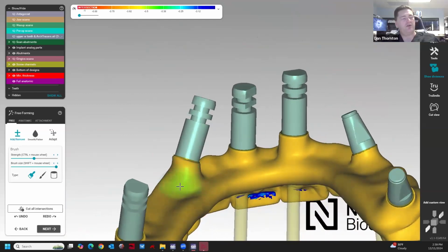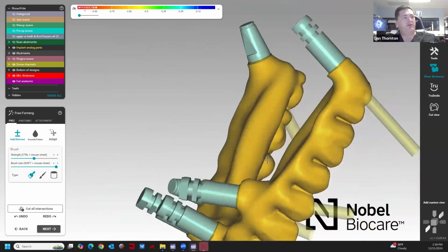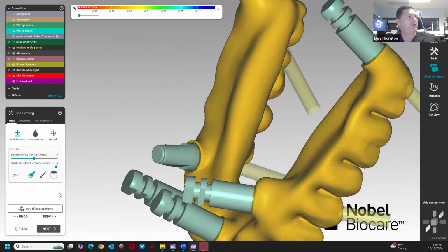But you have to remember you have your wash cycle or your hand washing for some of these materials. Then you have your curing time also on top of that, especially if you're doing this chairside.